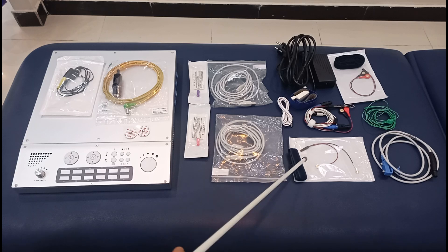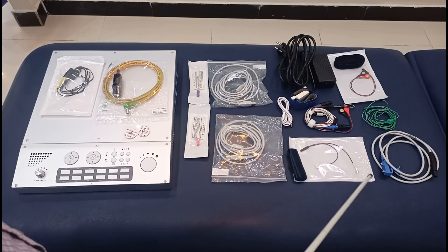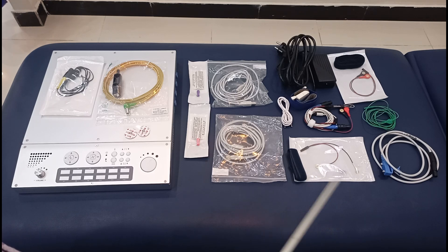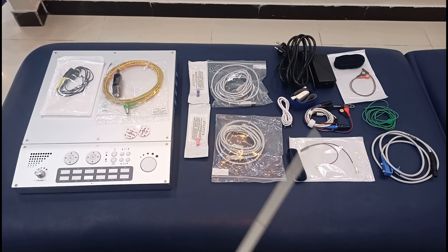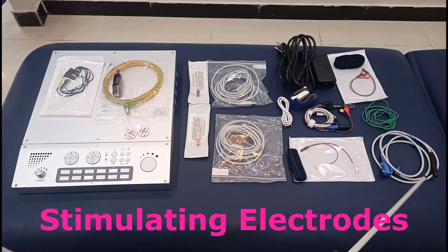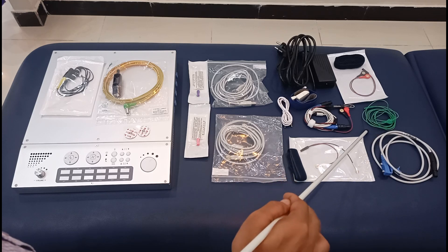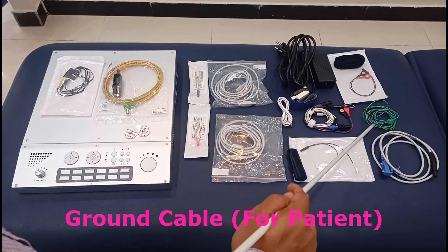This is a velcro, and these are the positive and negative electrodes. In NCS and EMG, we call them the active and reference electrode. These are sometimes called button electrodes. This is the stimulator, and it is used to deliver current using this machine while you are performing NCS. The green color wire is the ground cable used during NCS and EMG.